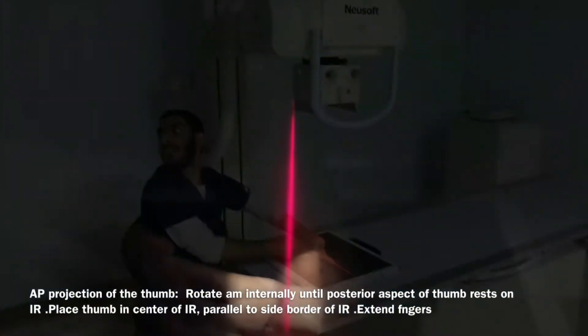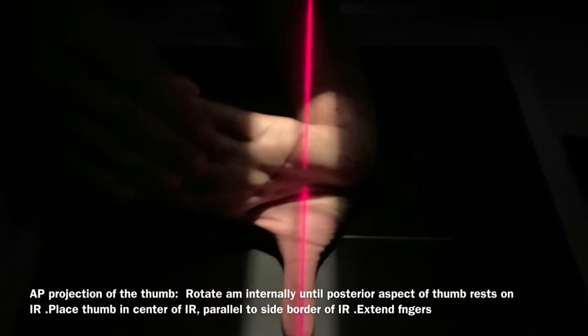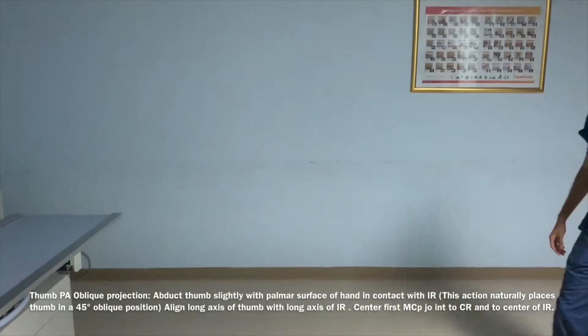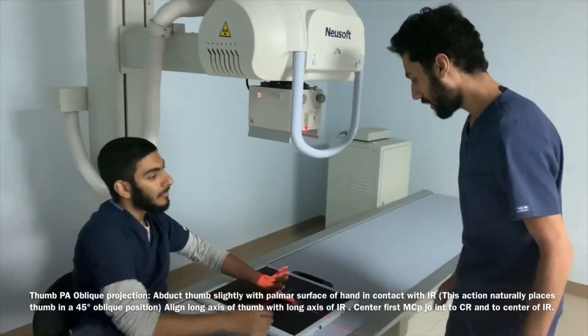Here's a better angle to view this routine position: anterior-posterior projection of the thumb. After the first photograph has been taken, he requests a slight modification to the previous position into an oblique posterior-anterior projection of the thumb.